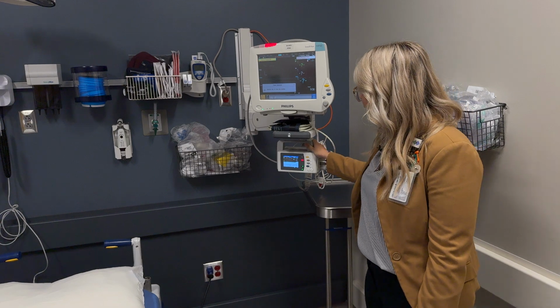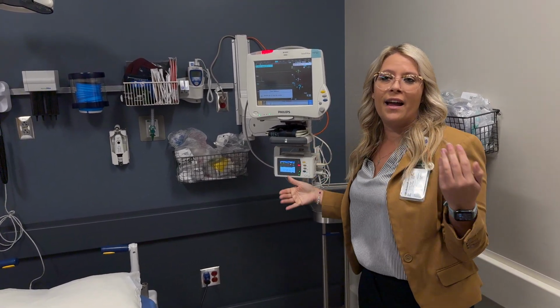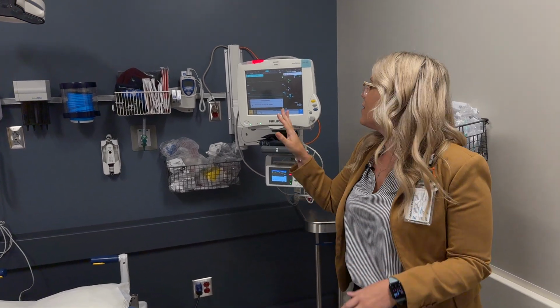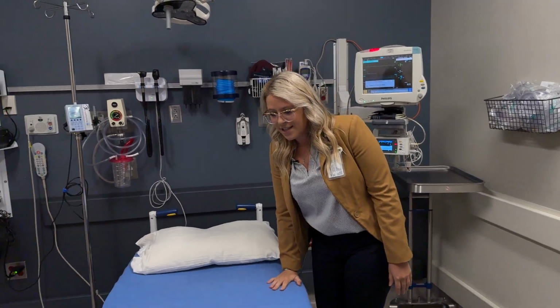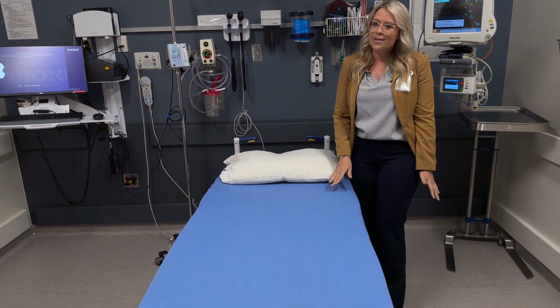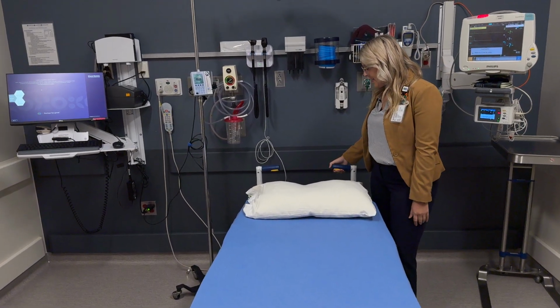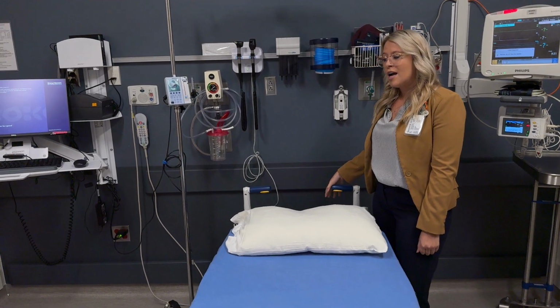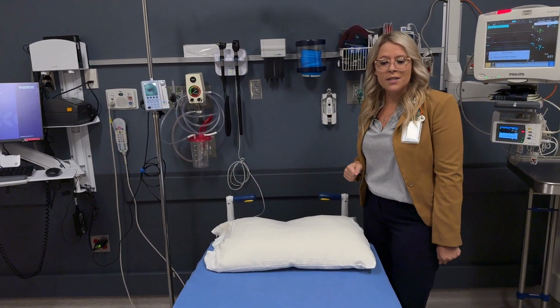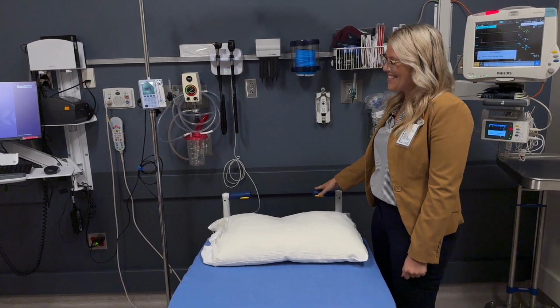And then we have the capability of disconnecting this and taking you elsewhere throughout the hospital and not losing any of your vital signs or any of the data that we collected with this. These are our beds. If you've ever sat in them, they're not always the most comfortable, but there's much less comfortable, I promise. And they're pretty fancy. They can drive, so it's easier on our staff. We just push these buttons and they kind of drive around. You don't need a license to drive them, but maybe you should because it can be pretty tough to steer.